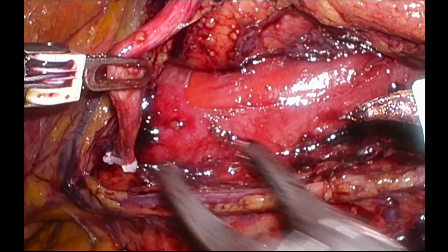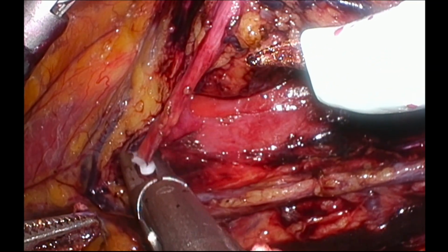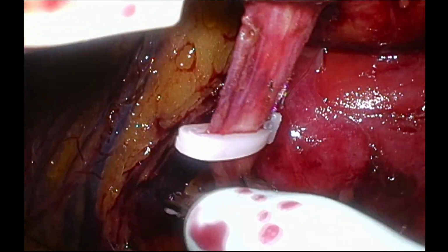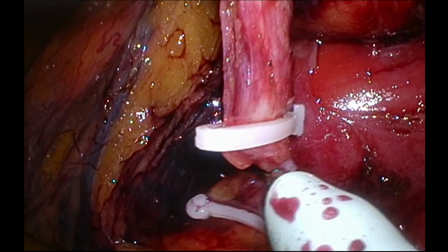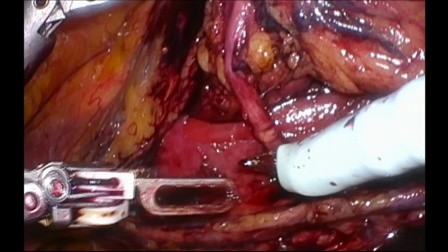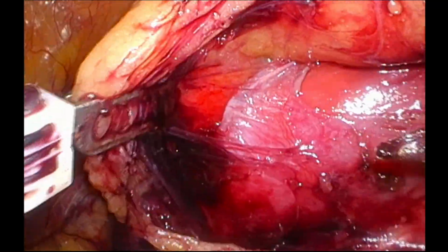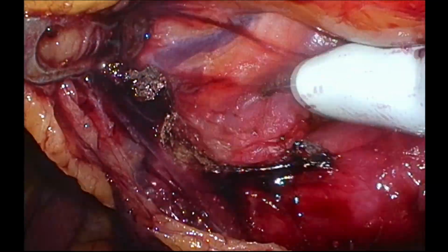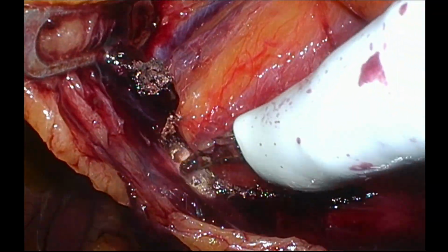Ureter is clipped near its crossing with external iliac artery and divided between the clips. Following this, rest of the perinephric dissection is completed.